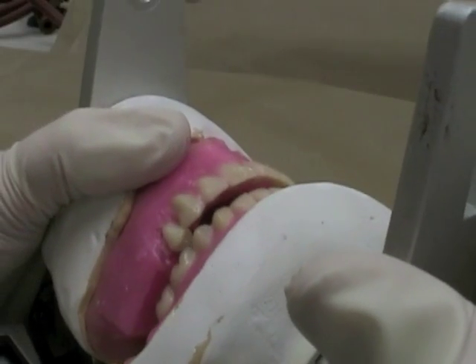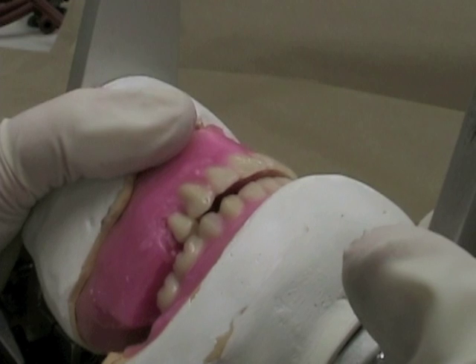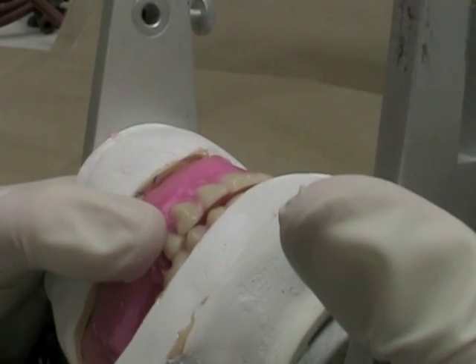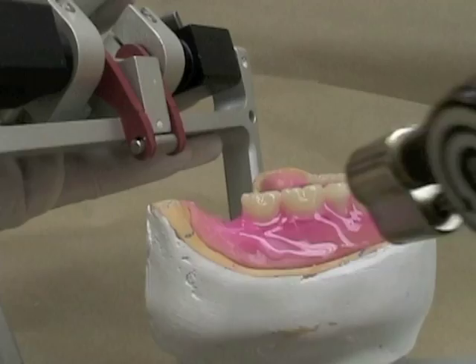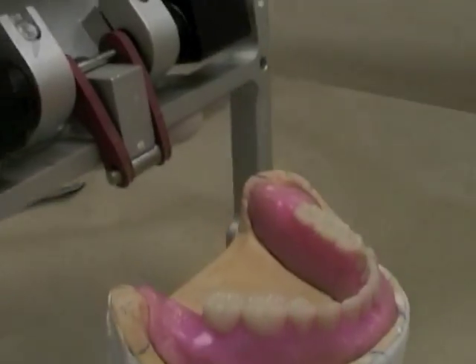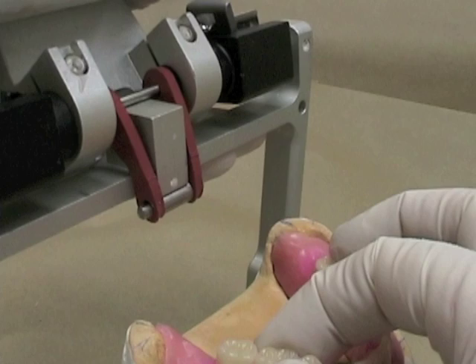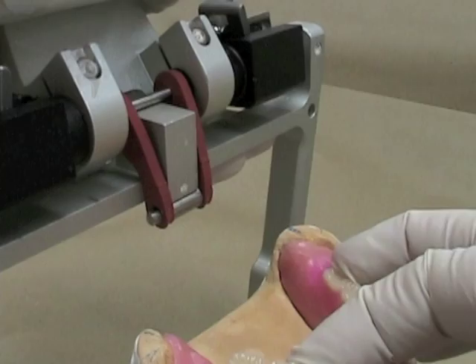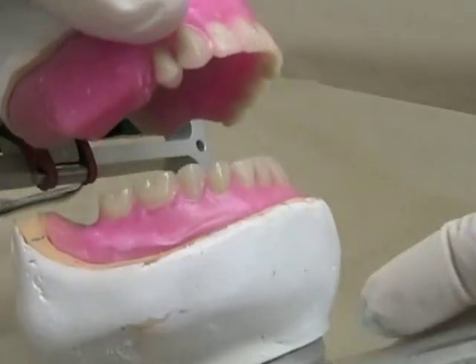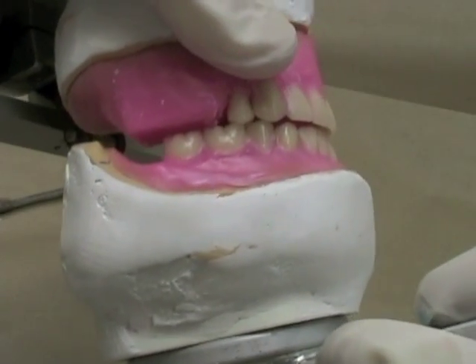In this particular case, I'm having difficulty getting my lingual cusp where I want without having no overjet. So what I'm going to do is actually move the lower teeth. I'm going to soften them up a little bit and move them in bodily toward the lingual surface so that it's easier for me to get my maxillary lingual cusp where I want.